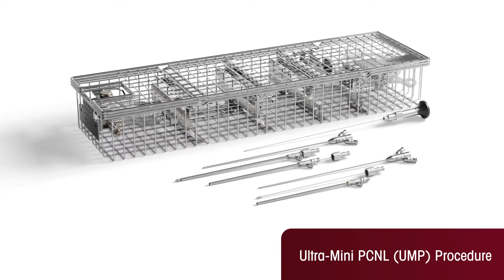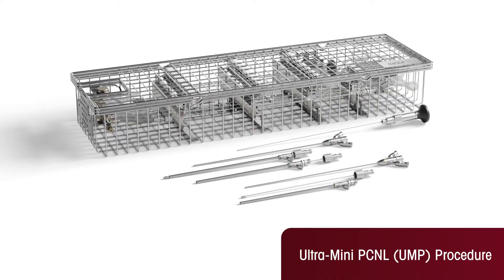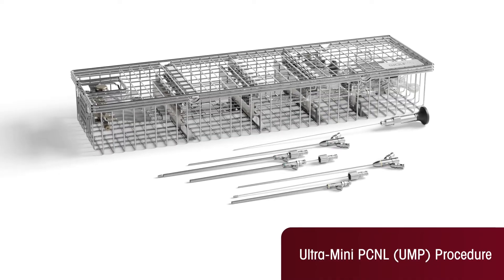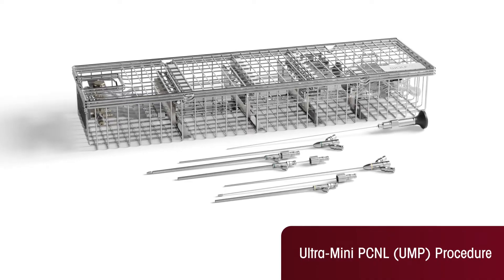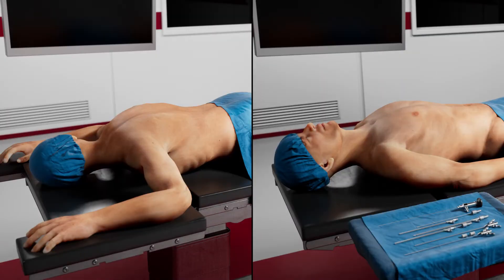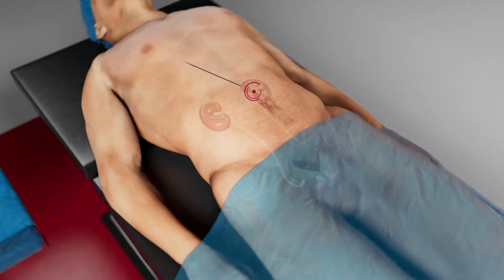Ultra Mini PCNL is a technique for the removal of kidney stones. The animation shows the UMP procedure with laser disintegration. You are placed facing up or down depending on the preference of the surgeon. The UMP procedure is carried out under general anesthesia or spinal anesthesia.